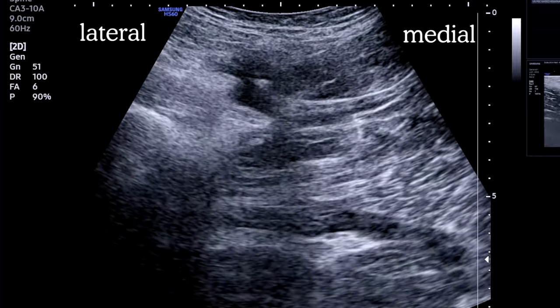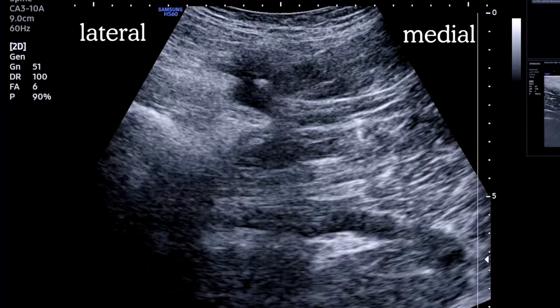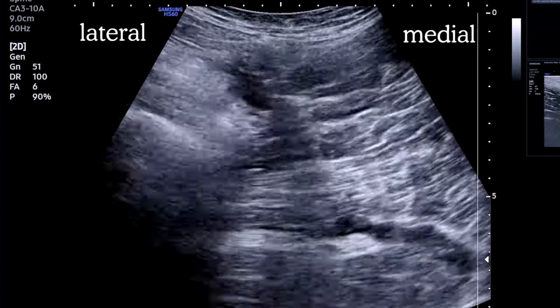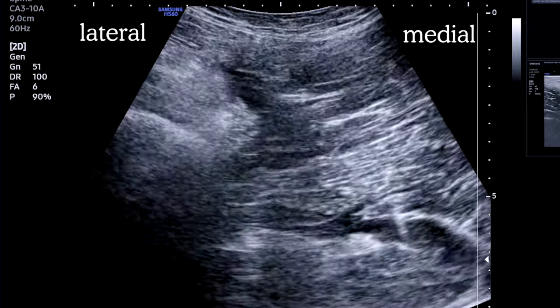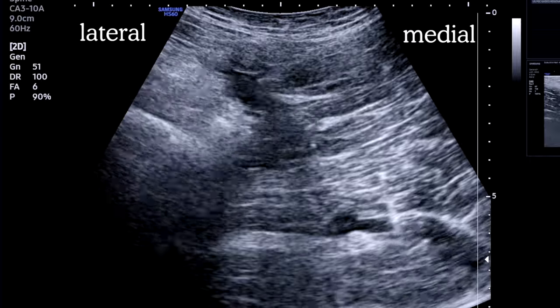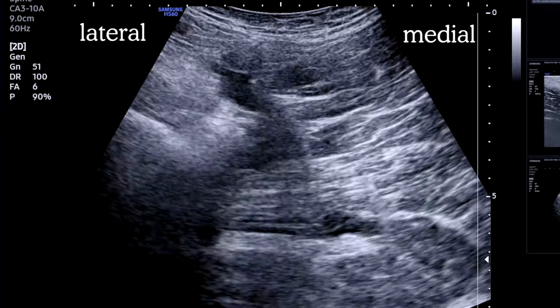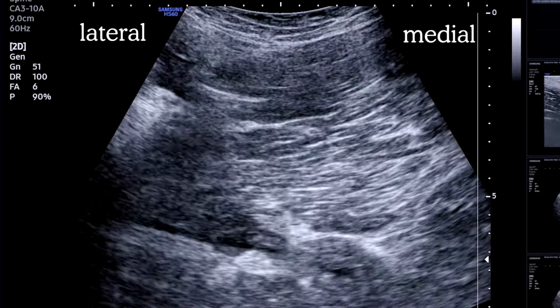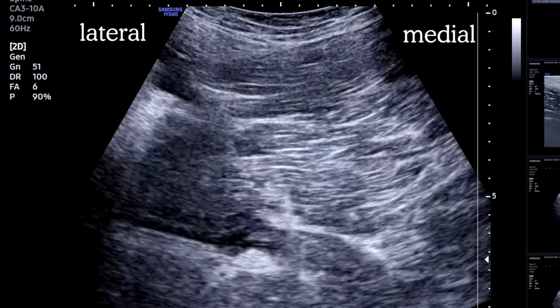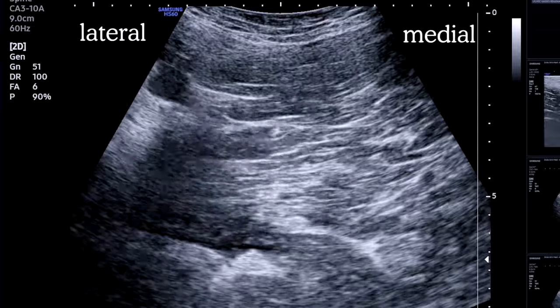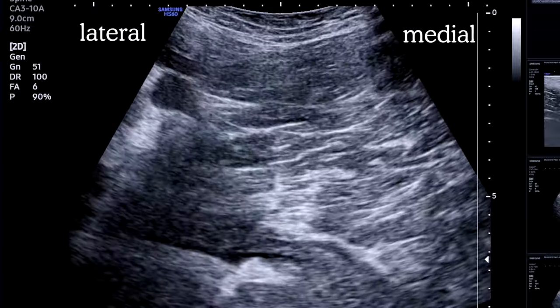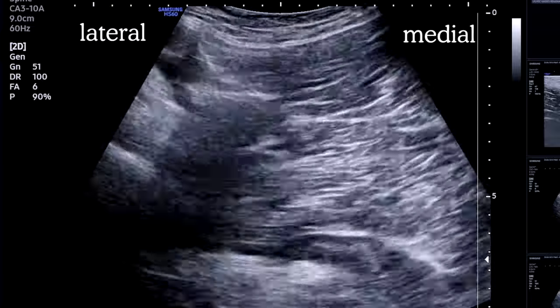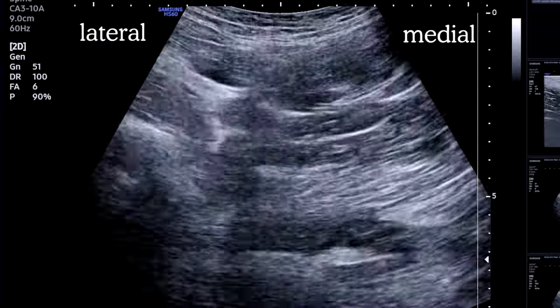Again, we see good fascial plane spread between the two muscles, running up and over the nerve. Notice the nerve becomes much more visible with some local anesthetic contrast beside it. A quick back-and-forth scan confirms we're happy with that pattern of spread, and we're good to go.